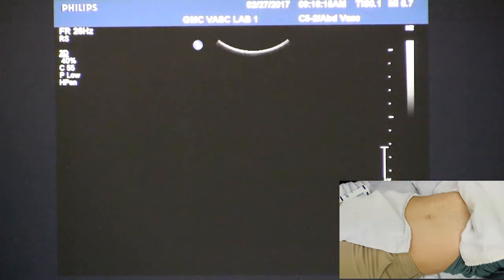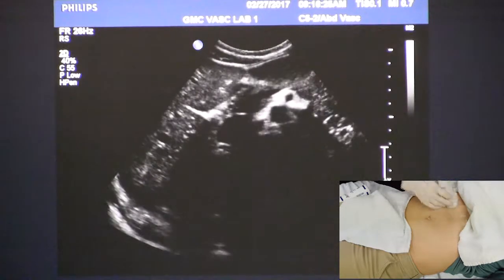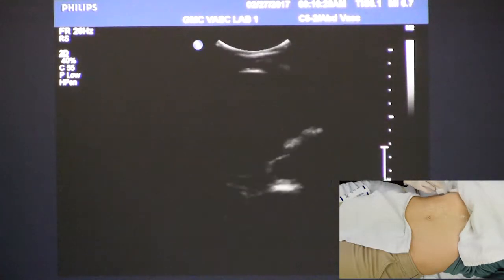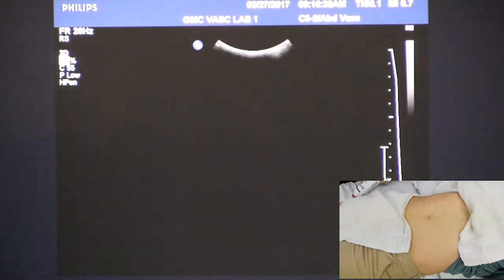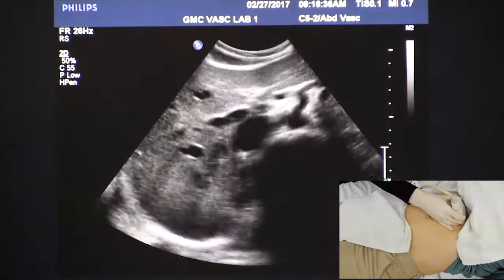Okay, now I'm going to do a basic liver Doppler with the protocol that's used for ScanLab. So there's two different regions we can get the portal vein. We can get it from the anterior abdominal window here, or we can get it intercostally out here from the side.